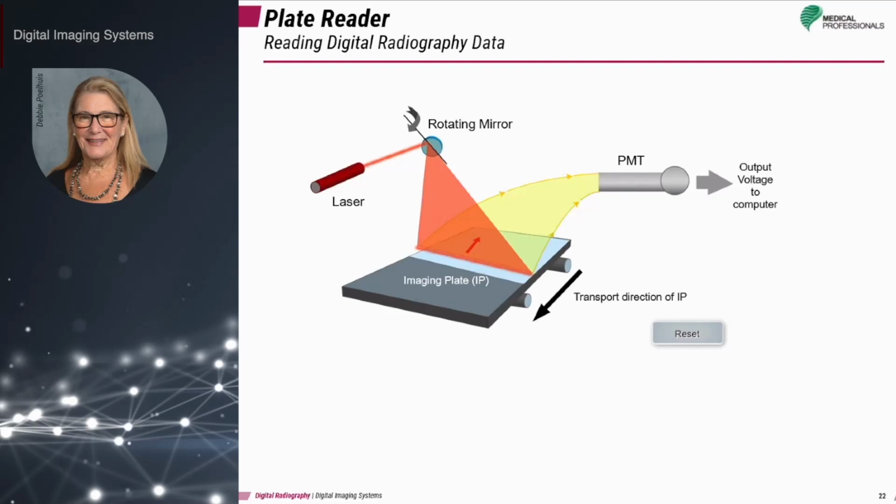The helium neon laser, or solid state diodes in some newer plate readers, is directed to the imaging plate while the plate is moving throughout the system.